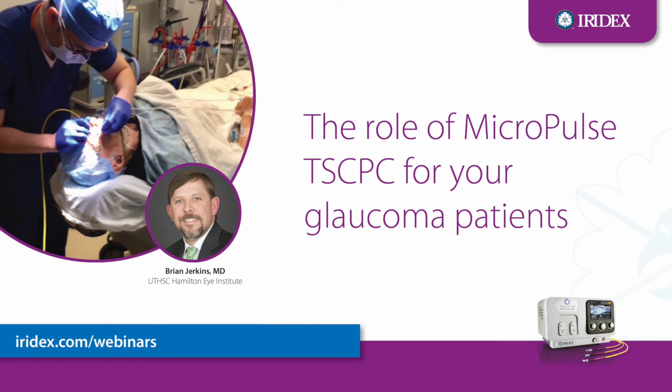Thankfully, the anesthesia doctors I've got right now actually do a pretty good job. So by the time their anesthesia wears off, we are done. It's just the little dance that we've developed. We've got a little system down, and yes, occasionally somebody might wake up a little bit, but right now we have it where they'll keep them under. If I'm ready to do the procedure, we can do it all in a good 5 to 10 minutes very safely, and the patient doesn't feel a thing.